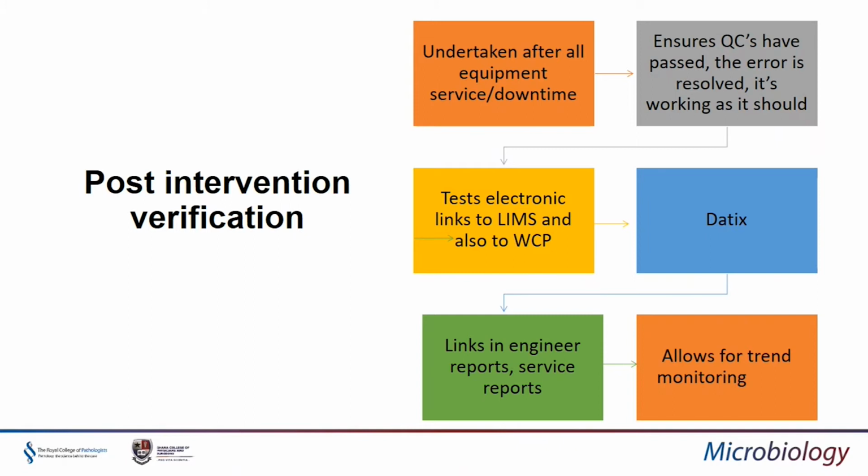And we also use DATIX. DATIX is our form of incident reporting. So if we had a particular bay on a particular molecular instrument that kept breaking all of the time, and every time it broke, we raised a DATIX incident report against that. When we do a DATIX report for a month, 2 months, 6 months, we can actually see how many times this has happened, and we can identify if there's any trends.